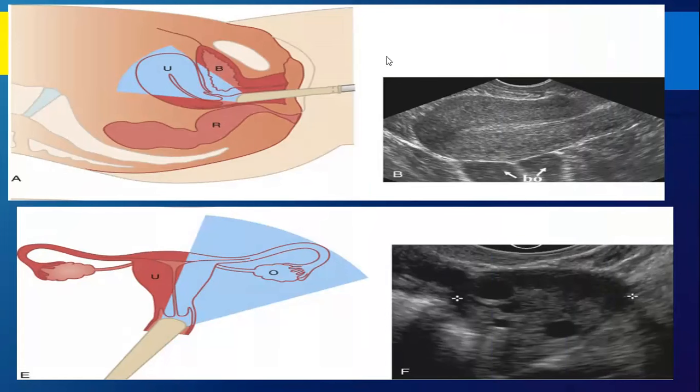So again, the steps of locating the ovary by the transvaginal approach. Of course, we would insert the probe as such and ask the patient to elevate her hips a little bit, or put a pillow, or take the probe a little bit outside, in order to locate and see the uterus. Okay, and we will use the LS to locate the uterus, and then we change to the TS and trace the ovarian ligament in order to see the ovary.